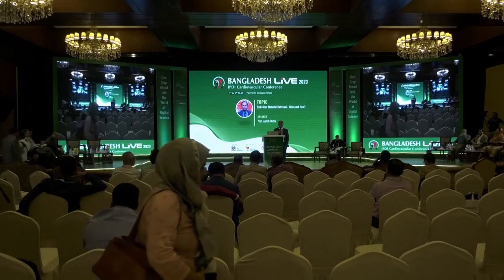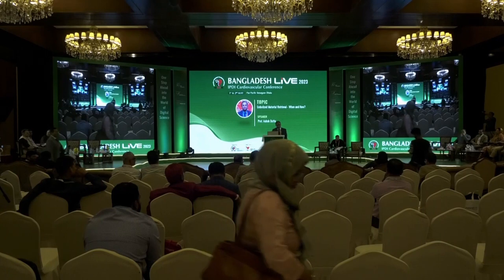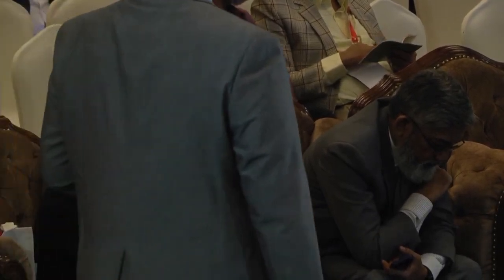Ashok was asking because we did, as seniors, a lot of cases, whether we faced it or not. This is true, but we have also learned from our mistakes, and that's why we can tell you again and again. When you're doing it, as I always say, make sure your guide is sitting nicely and is not going to pop up every time you do something. Then you're aware. If it goes nicely, then you know that, and always keep an eye on the tip of the wire where it has gone.